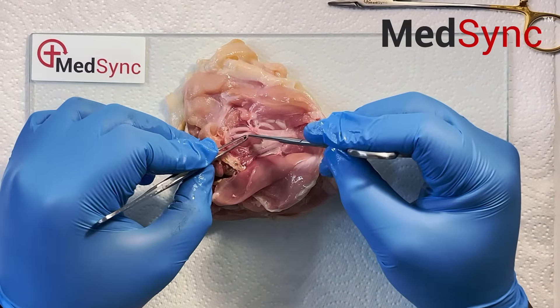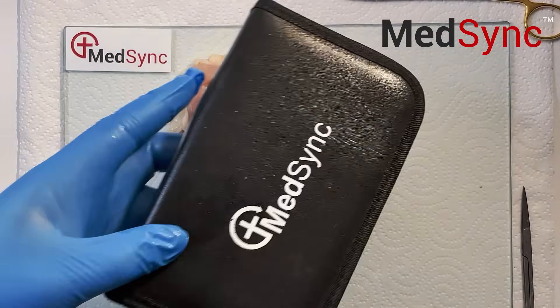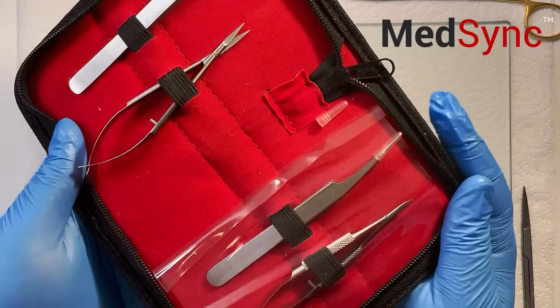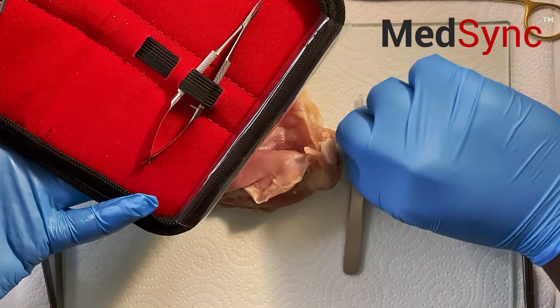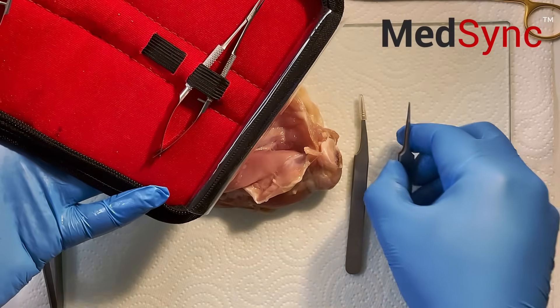This is the vein, this is the artery, and this is your nerve. We're going to take our micro-instruments by MedSync. We want the dilator — it's got a curved edge — and the forceps, the jeweler's forceps, with the straight edge.